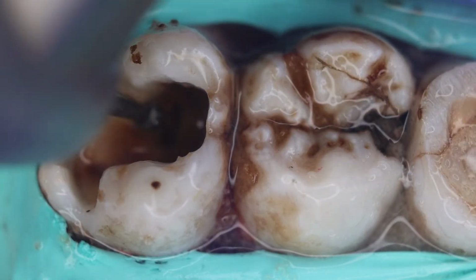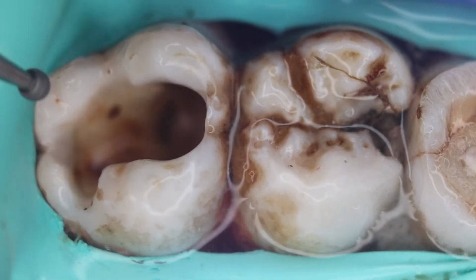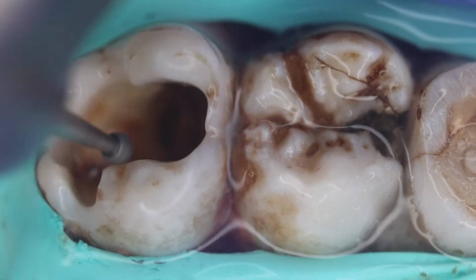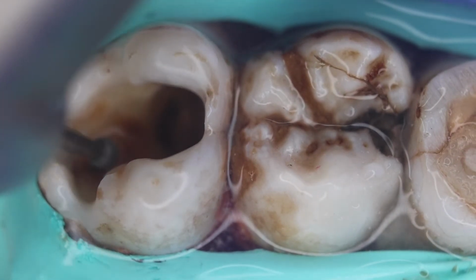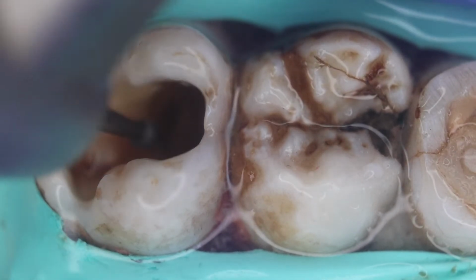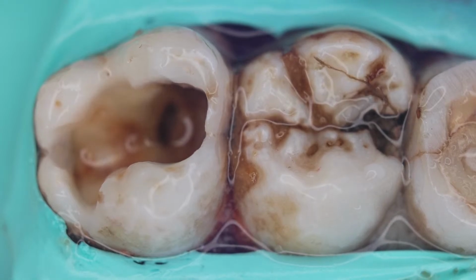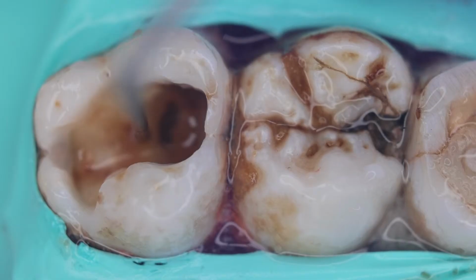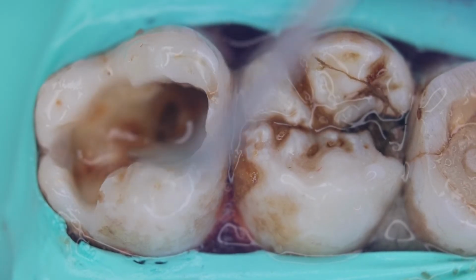So this is how you can remove the caries that is there with the help of the round burr. So this should be your final cavity with the rounded angles.